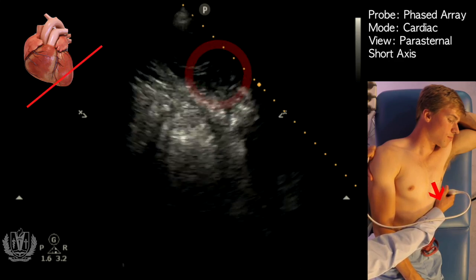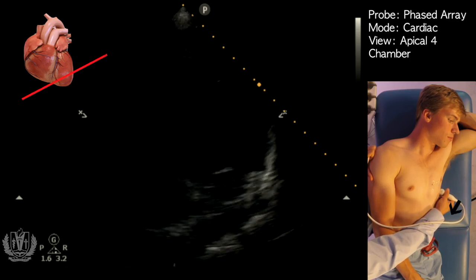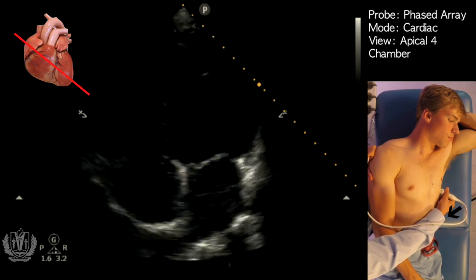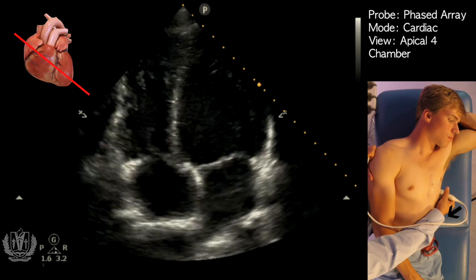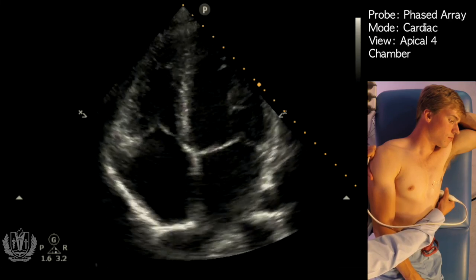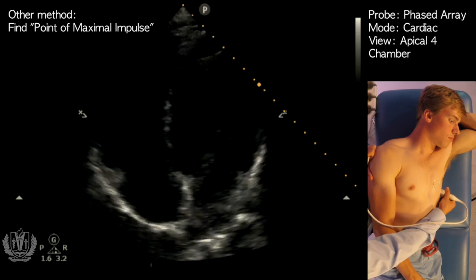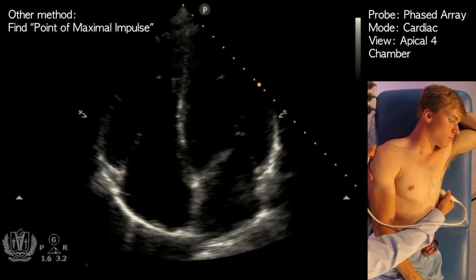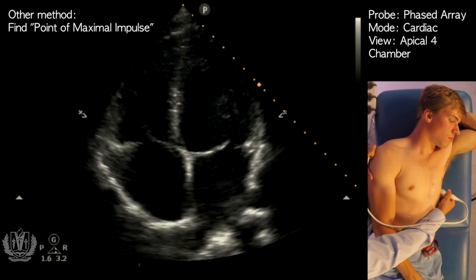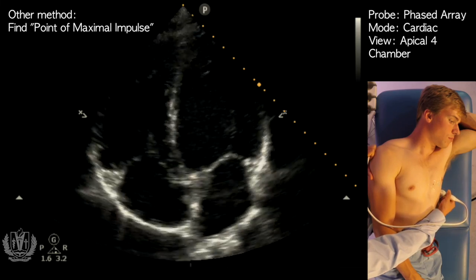Once you reach the area where it's the smallest, you tilt your probe down and you can get your apical four-chamber view. That's the easiest way to find the apical four-chamber view. You can also feel for the PMI and place your probe there, especially for females if you can't use the approach described.